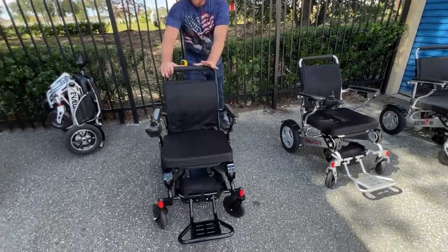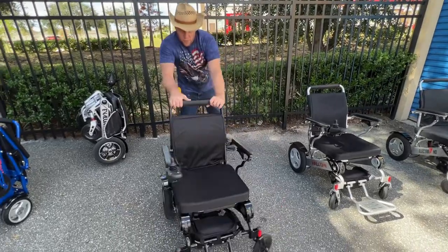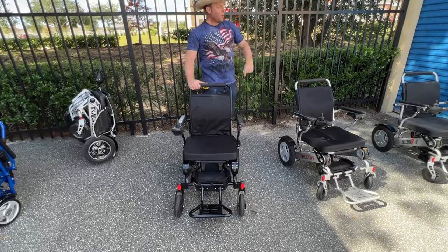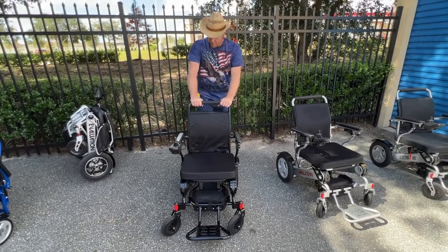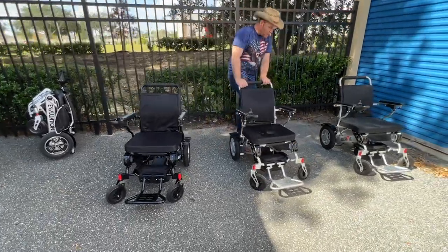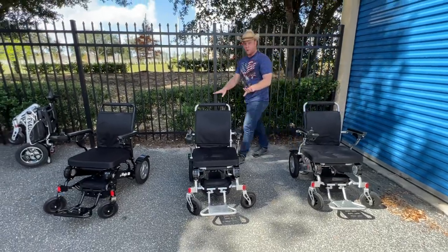This chair is in freewheel mode as well. It has exactly the same wheels and exactly the same motors as the Electra 7. So we'll put this one here for now and lock it up — these chairs are ready to be turned on.